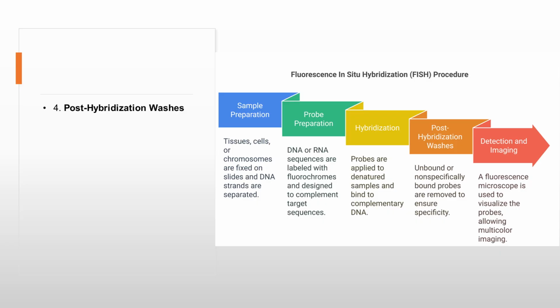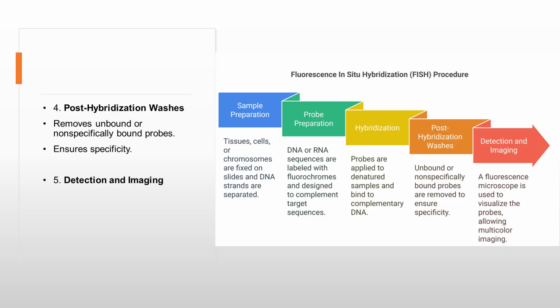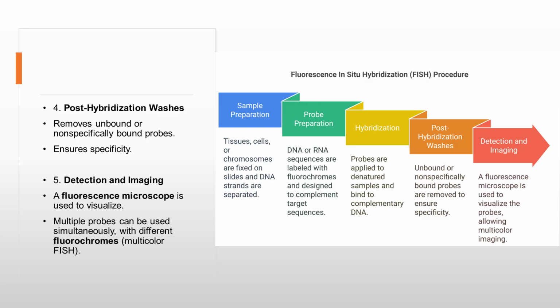Post-hybridization washes remove unbound or non-specifically bound probes. This ensures specificity. Detection and imaging. A fluorescence microscope is used to visualize. Multiple probes can be used simultaneously, with different fluorochromes, called multicolor FISH.